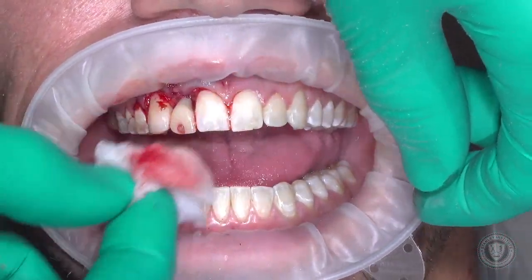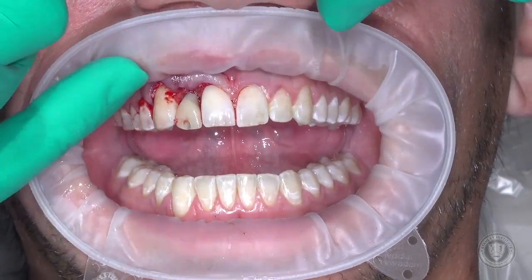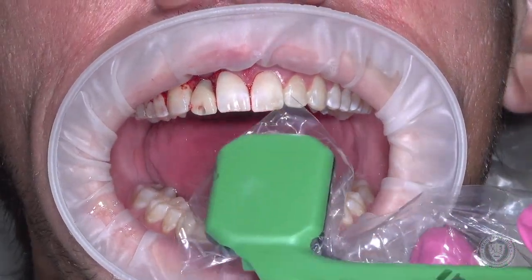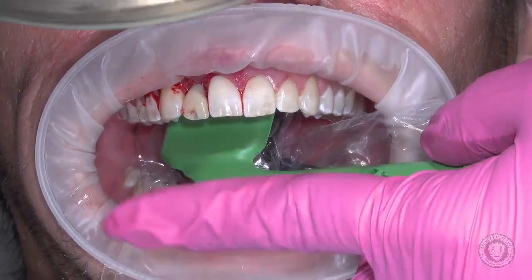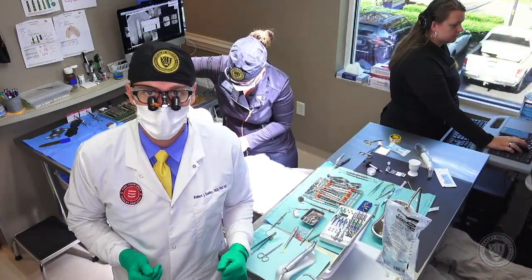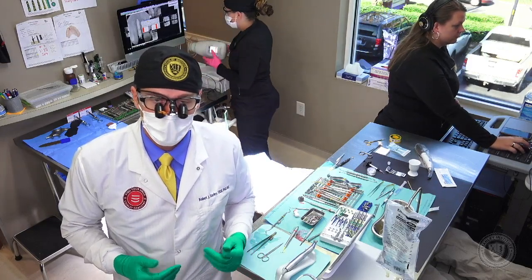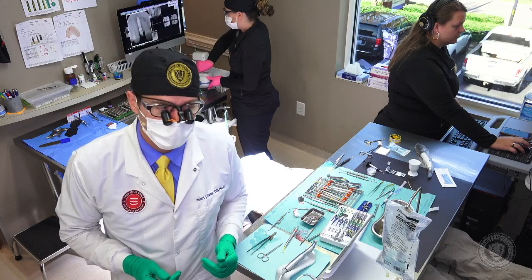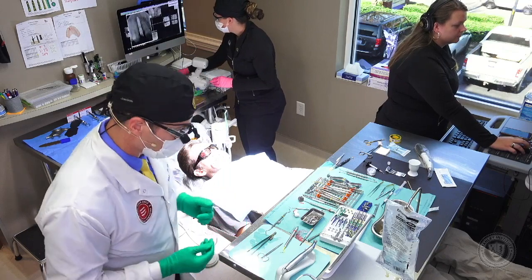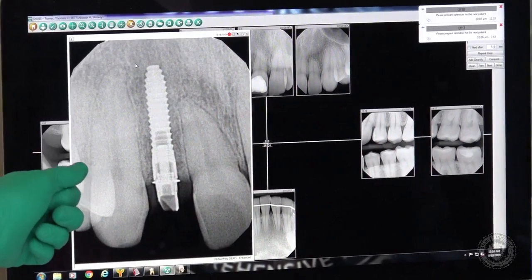One last radiograph verifying that our temporary is in the right position. Then we're going to close this up. I'm going to use a sling suture, which is one of my favorite sutures to use with most of my periodontic work — like the Pat Allen technique where we do a coronal advancement for root coverage with AlloDerm, where we would use a fair number of sling sutures. We've got our last radiograph and it looks spectacular. Everything looks good, let's go ahead and close that up.